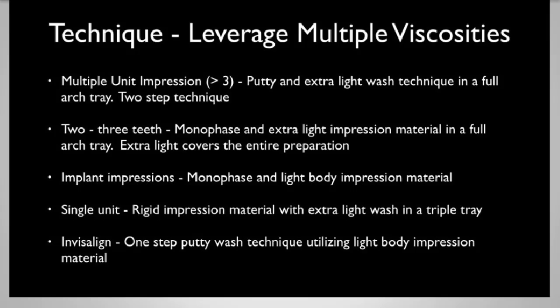Now for 2 to 3 teeth, a much simpler process. I'm not as concerned about the tray. I still use a full arch tray for multiple teeth. In this case, I use a monophase material with the extra light body wash again. Do it all in one step. The reason I use a monophase here is I get enough stiffness in the material to get some compression force. But at the same time, the material is not so stiff that I'm concerned about it locking into place and not being able to remove the tray.